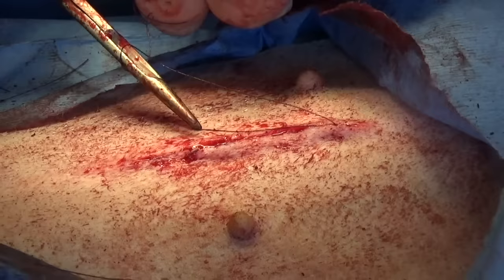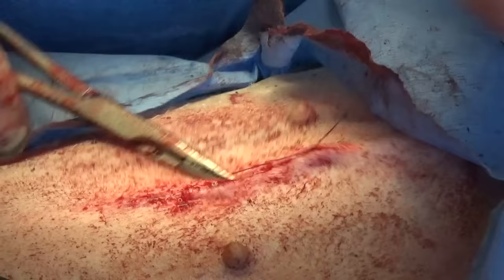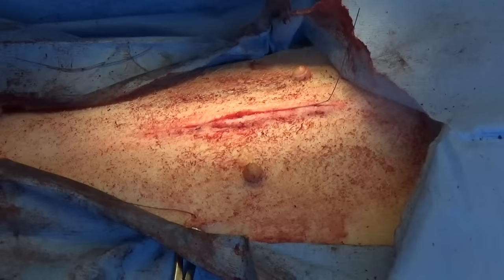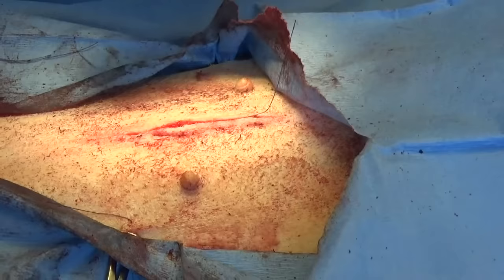And then we got to cut these real close because we don't want those little ends sticking out. So we don't want to cut the knot, but we want to make sure that. So we're going to do that. And then look and see if there's any others that need to be shortened up.